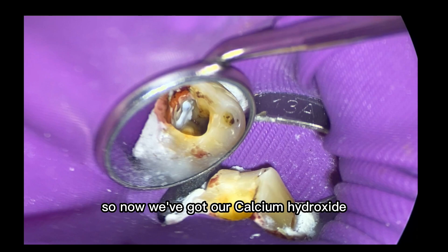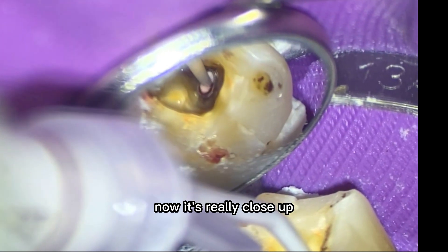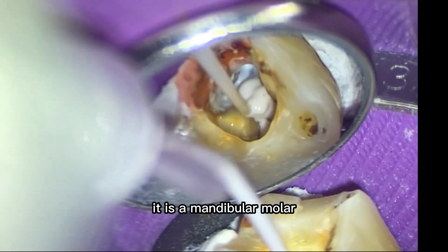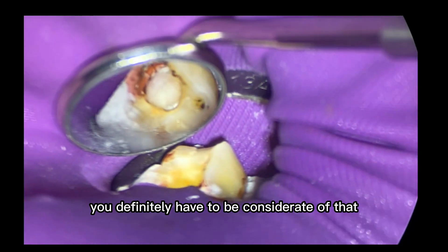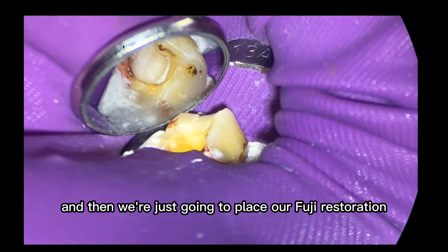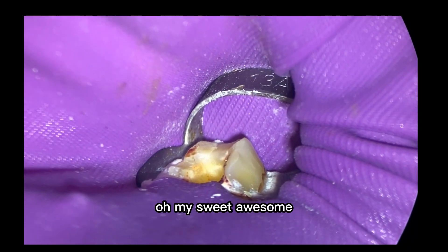Now we've got our calcium hydroxide in our mesial canals. We remove the paper point from the distal canal and place this — it's really close up, not deep down the canal, so I'm not worried about extruding. It is a mandibular second molar, so this one is close to the inferior alveolar nerve — you definitely have to be considerate of that. Then we place our Fuji restoration. I called the patient the next day and the patient's totally fine.